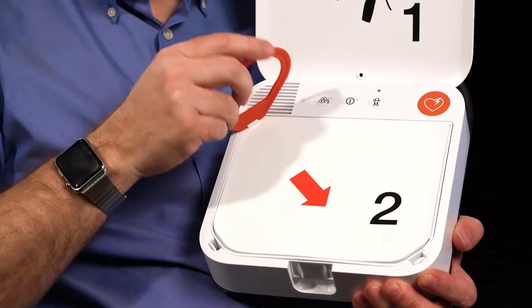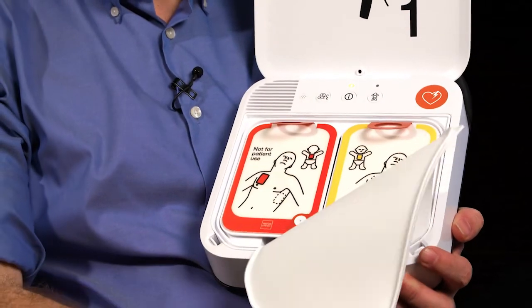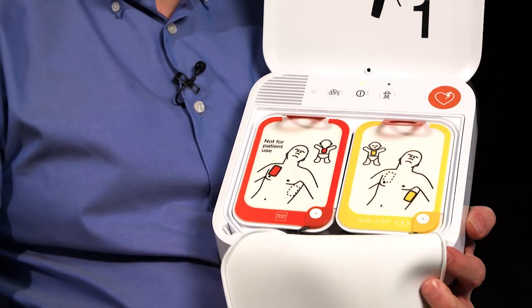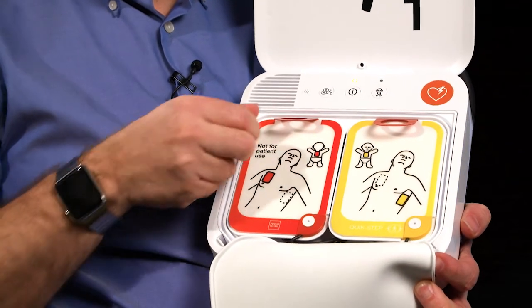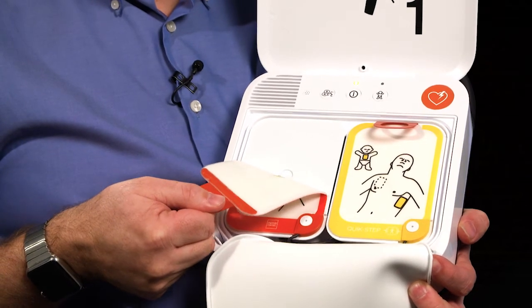When using the CR2 on children, it has a mode which delivers appropriately lower energy levels without having to change the electrodes. The CR2 produces up to 360 joules for more effective shocks when they're needed.